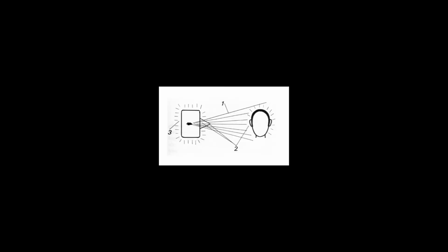Next point is what are the sources and the risks of the radiation. Well, there's primary, there's secondary, there's tertiary, and the primary one is going to be the radiation that you get from taking the X-ray in the first place. It's shot straight at you. The secondary is that which bounces off the walls and the roof and the ceiling and the floors and then the chair or whatever, and then bounces at you. That wasn't specifically aimed at you, but it was bouncing back at you. And then the third is whatever leaks out of the X-ray box itself.